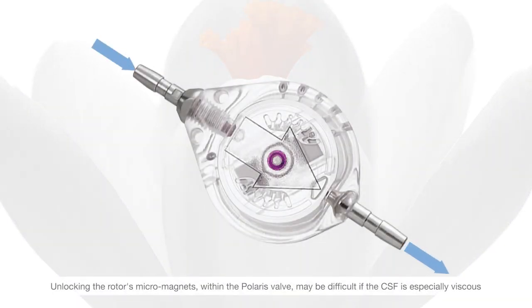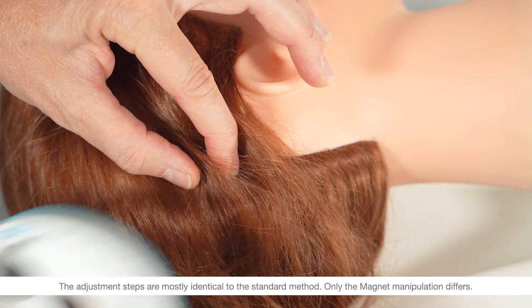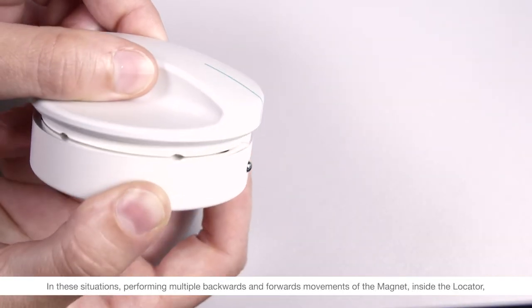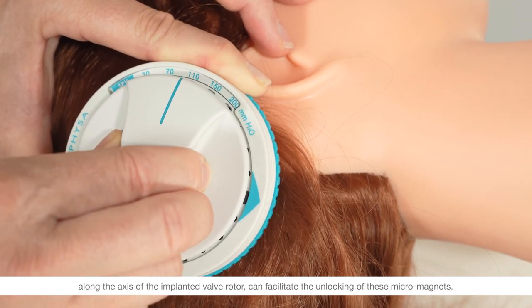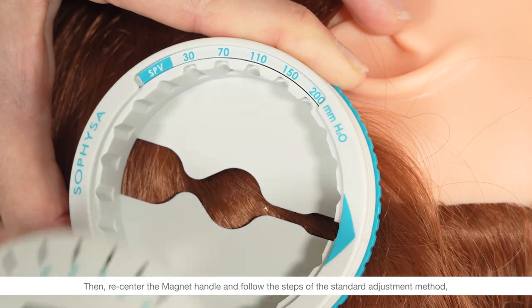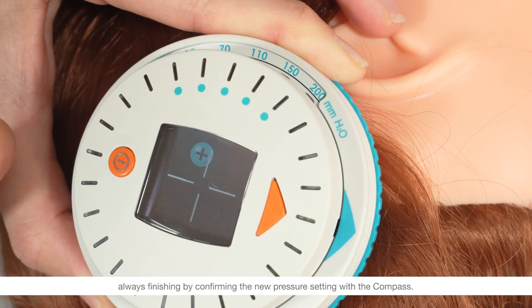Unlocking the rotor's micromagnets within the Polaris valve may be difficult if the CSF is especially viscous or contains debris, or if locating the center of the valve is imprecise. The adjustment steps are mostly identical to the standard method; only the magnet manipulation differs. In these situations, performing multiple backwards and forwards movements of the magnet inside the locator along the axis of the implanted valve rotor can facilitate the unlocking of these micromagnets. Then recenter the magnet handle and follow the steps of the standard adjustment method, always finishing by confirming the new pressure setting with the compass.